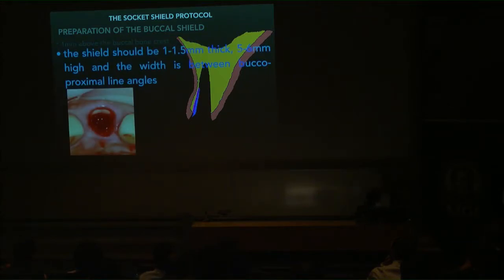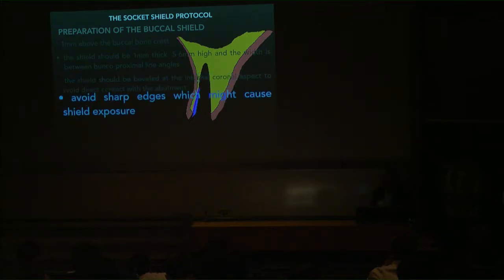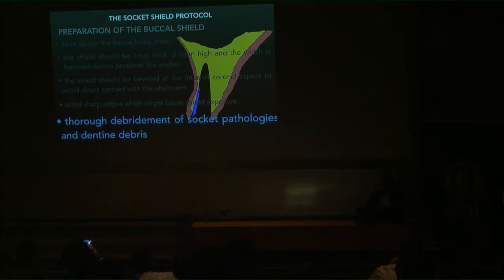The size of the shield should be as large as needed for its intended purpose, which is to protect the buccal bone, but it should be as small as possible so as not to compete with the osteogenic potential of the available bone within the socket. The shield should be beveled so as not to come in contact with the abutment or the crown. Avoid sharp edges which might cause exposure. As with an immediate implant, the debridement of the socket is essential.